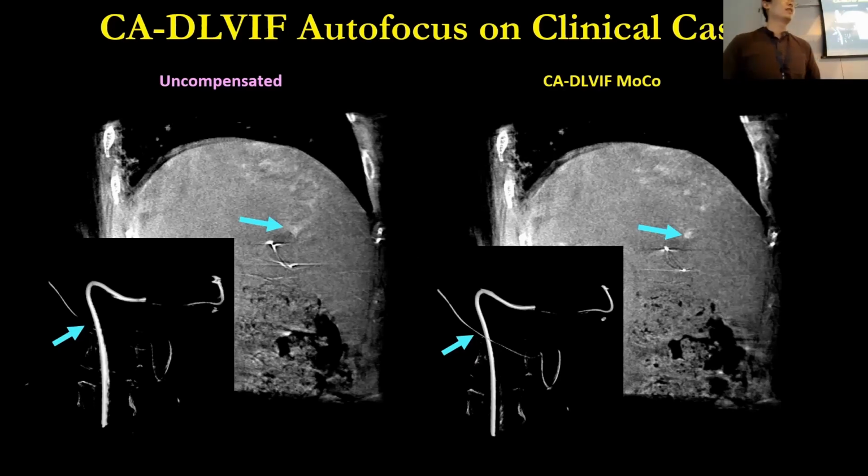Oh, yes. So basically, when we simulate the data, we randomly put the motion vector field inside the body. The point here is that we want the network to learn what the real appearance of anatomy is, so that it can be aware of whether this reconstruction is correct. So actually, we want to add motion artifacts to the static region so that the network knows that is not the correct answer. So it will try to avoid that as well, and also learn what the correct representation is.